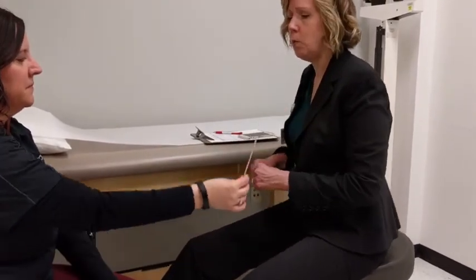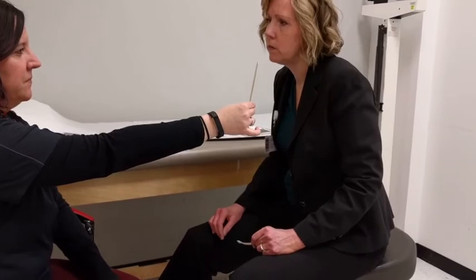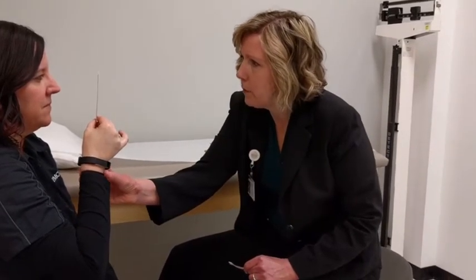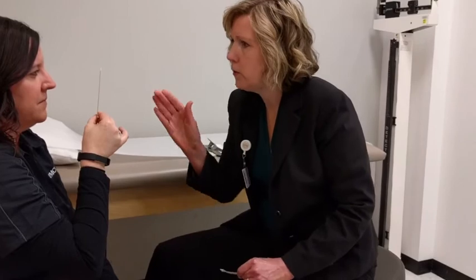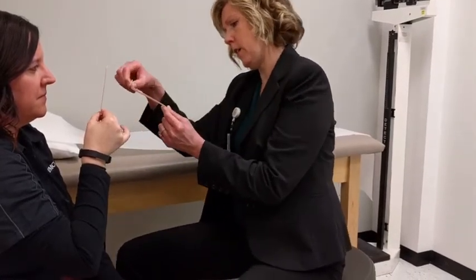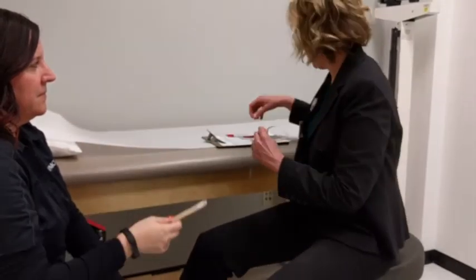And then can you do that one more time? Bring it on in towards you. I'm going to have you stop it right there because I see one of your eyes drifting out. So let me take a measure there. Okay, and that is 9 centimeters.